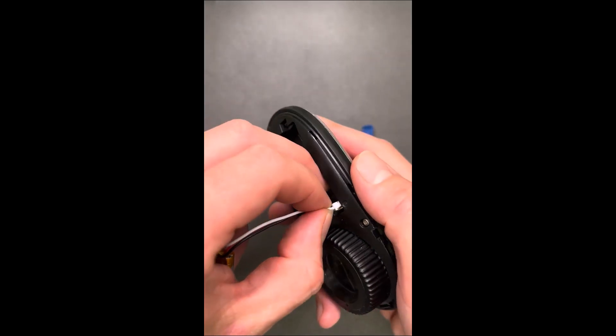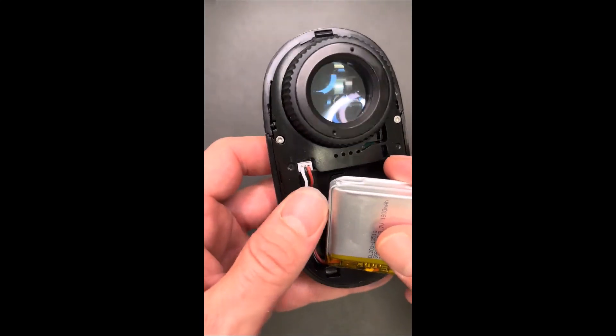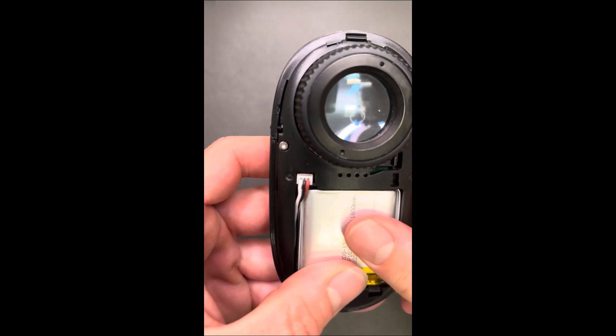You'll replace the battery by first plugging in the 3-pin connector. Then, tuck your wires underneath the battery itself so that they are not prone to getting pinched.